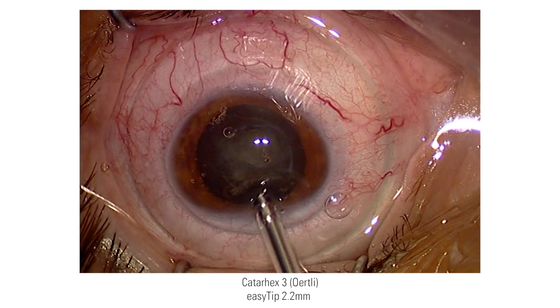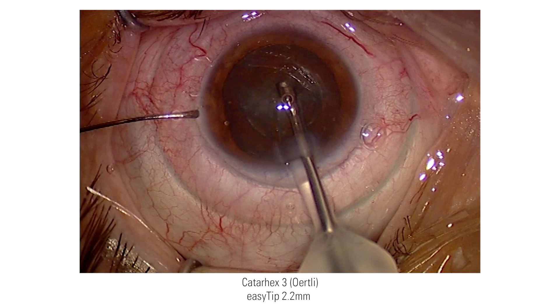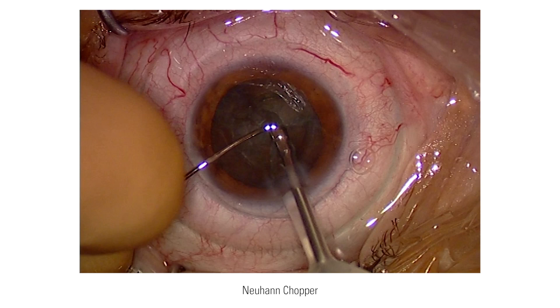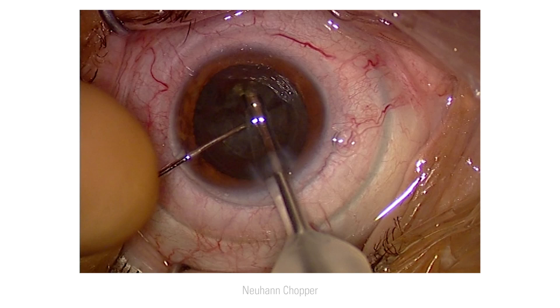The phaco tip is 2.2 mm and defines the width of the main incision. This is another advantage of the laser because I can pre-program the width of the corneal incision precisely according to the instruments I use. One of them is the Neuhand Chopper.